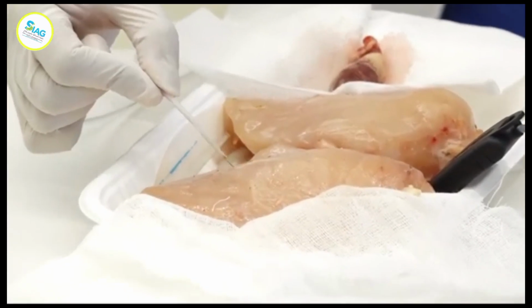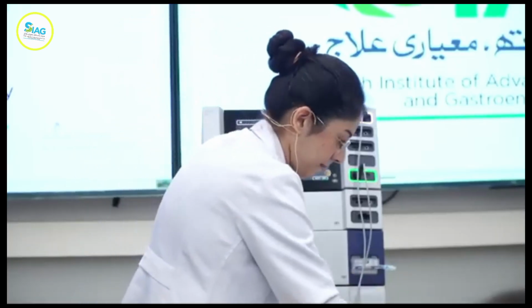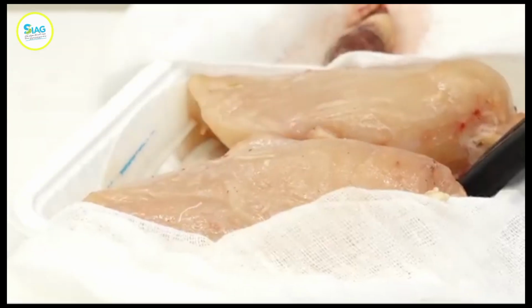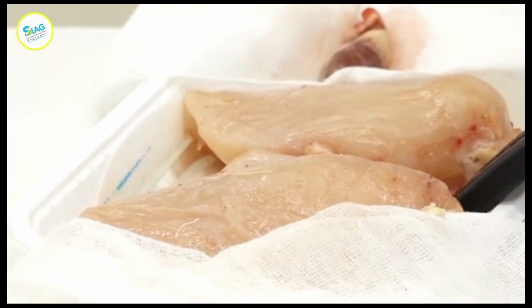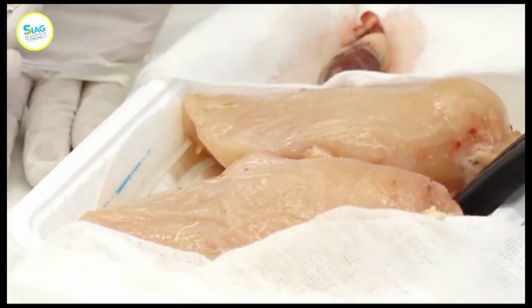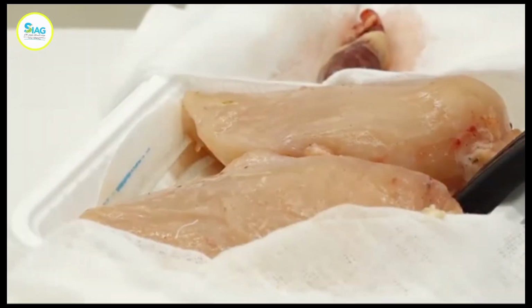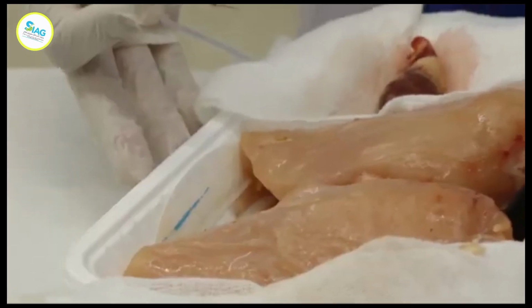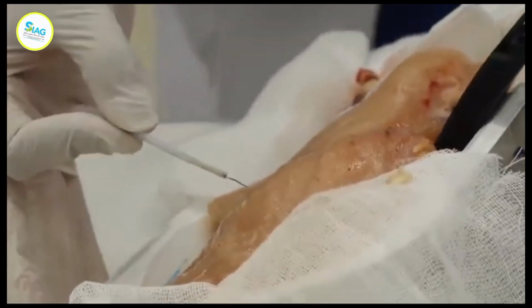I hope you can appreciate 2 kinds of sounds. I'll go again. And also you see that when you burn, can the camera show it here? Like a smoke. Did that show? Okay. Sometimes you see that. That's not smoke. That's vaporized water from the cells. It vaporizes so quickly, it looks like smoke inside. But it's just water. It's steam. So again, I'll show you at 2.